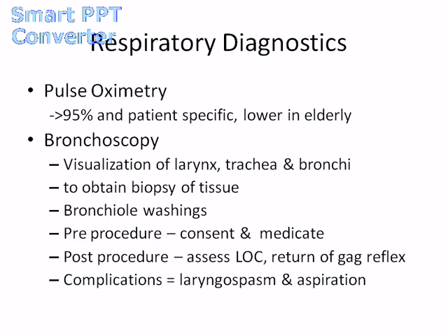So when we go to do that, we want to make sure the patient's on O2 if ordered and it is connected, and make sure everything's all connected up. If you get a low reading, make sure that your oxygen's connected to the wall and that it's running. Other things that can give you slightly lower values would be patients who have a dark skin coloration.